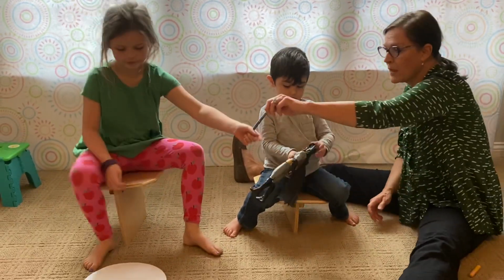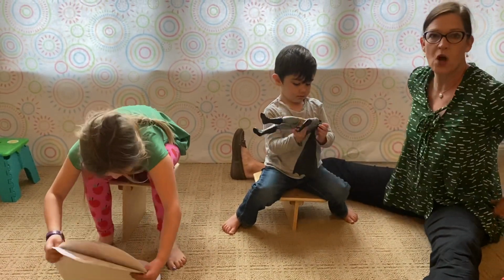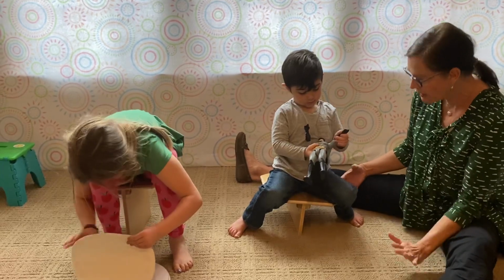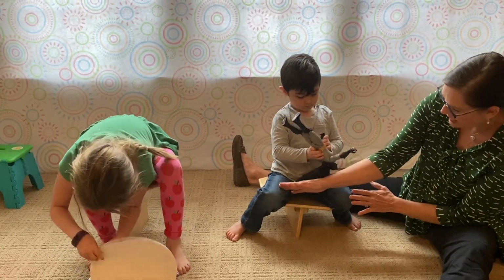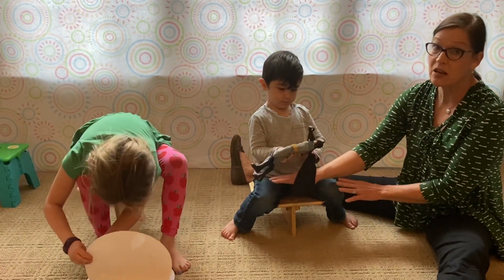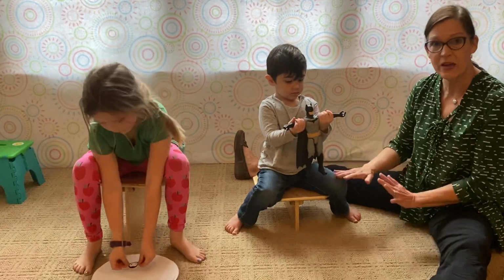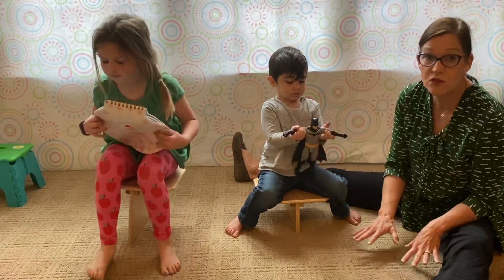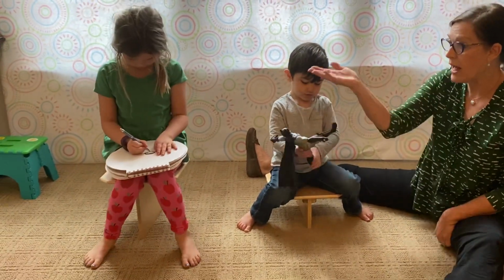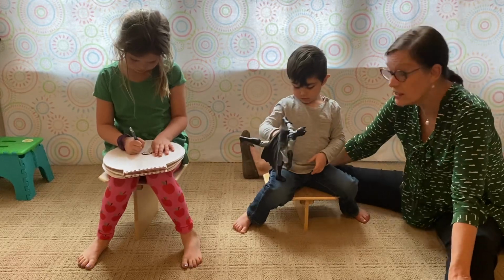Yeah. Okay. So I'm just letting them do whatever they want as they start to master sitting on a T-stool, having what we would call kind of comfort level and automatic control. But the real technical term is they're disassociating their legs from their uppers. The legs are going to learn to have their own isolated control, much like you have to have with soccer. But the uppers are going to learn some manipulation separate of their legs. So we don't want postural overflow or associated movements, which would be less coordinated, but we want independent uppers from the lowers.